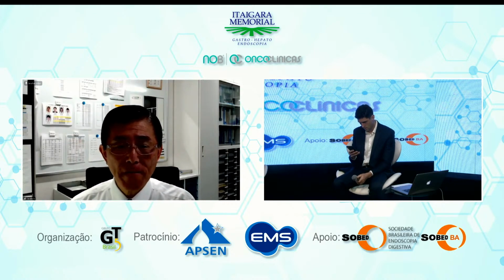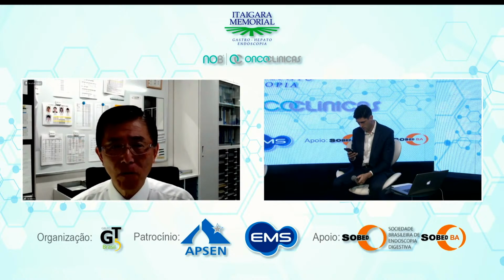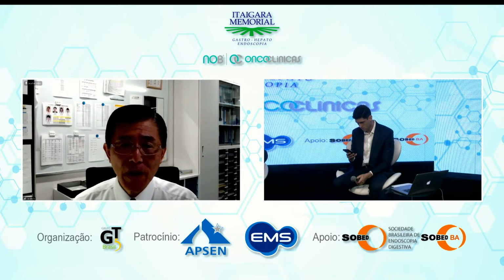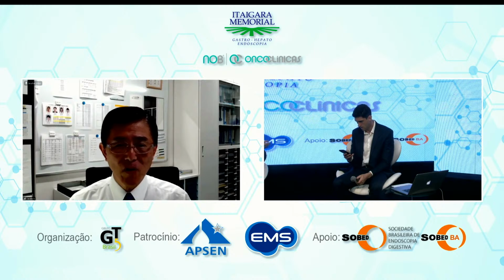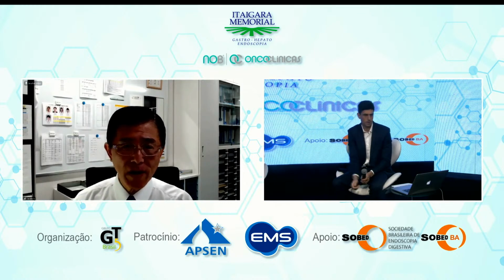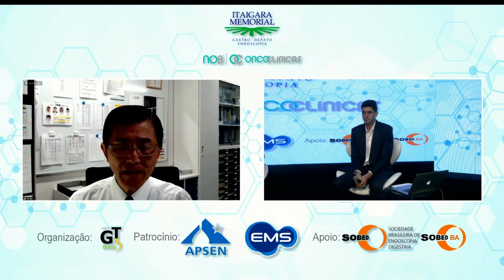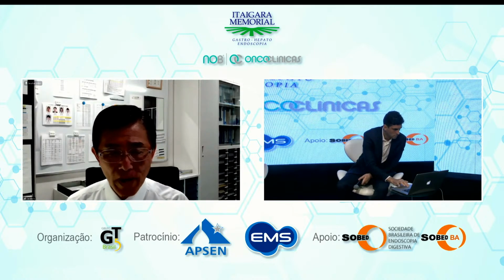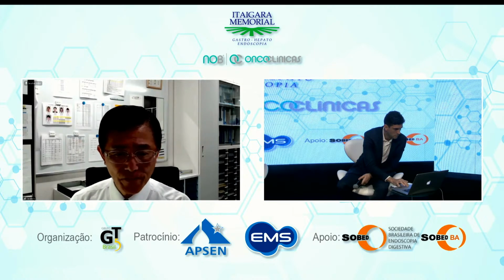Yeah. Nowadays, magnification is essential for colorectal colonoscopic examination, because even without a chromo agent such as indigo carmine, we can easily distinguish between non-neoplasia and adenoma, and between benign adenoma and carcinoma.